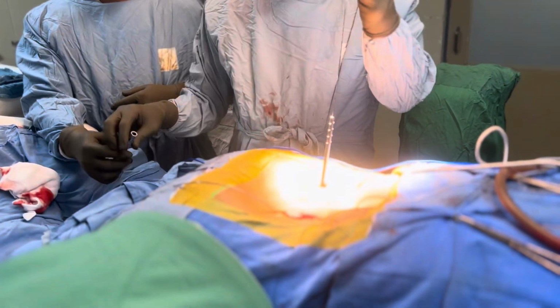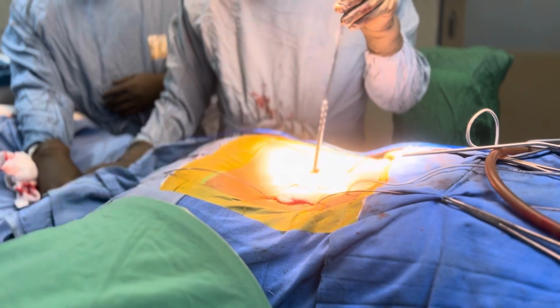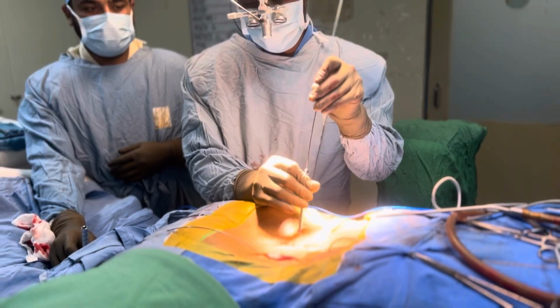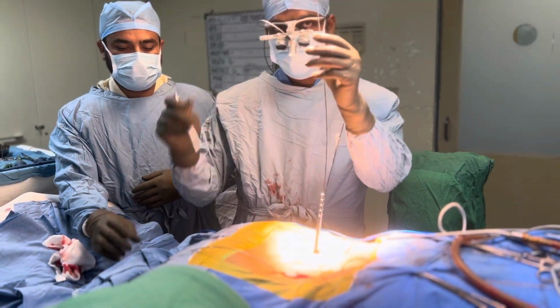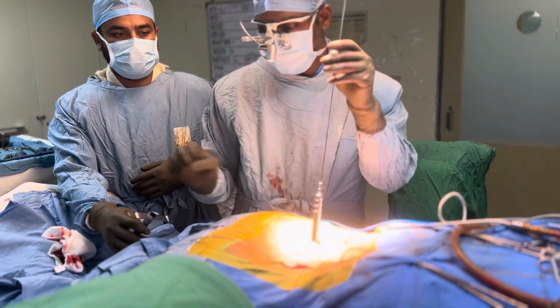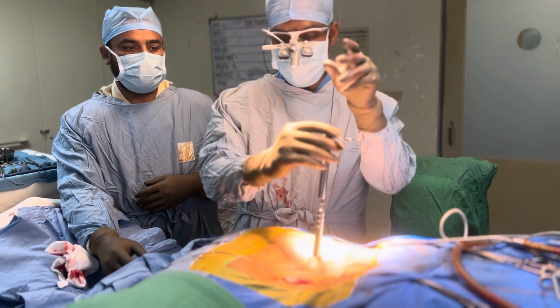These are the sleeves. This is the first sleeve. By rotational movement you need to insert it till the lateral border of the facet. Then the second sleeve, then the third sleeve. Everything goes on the guide wire now.